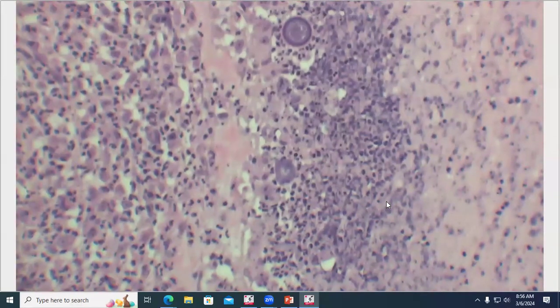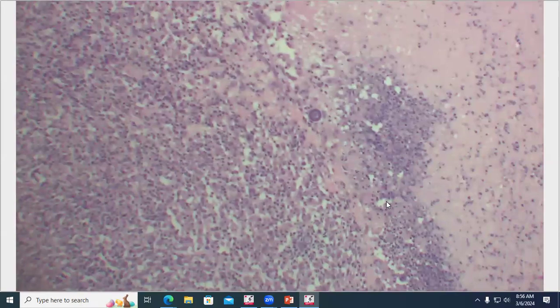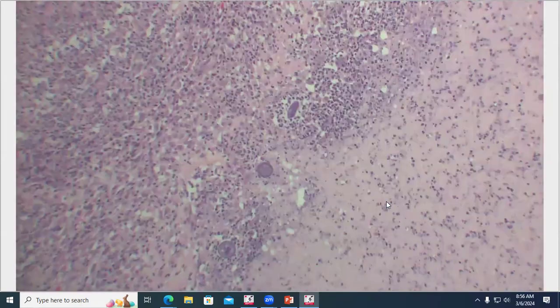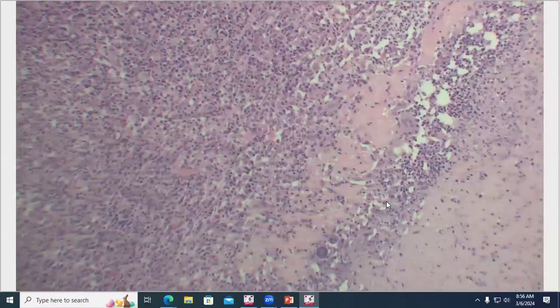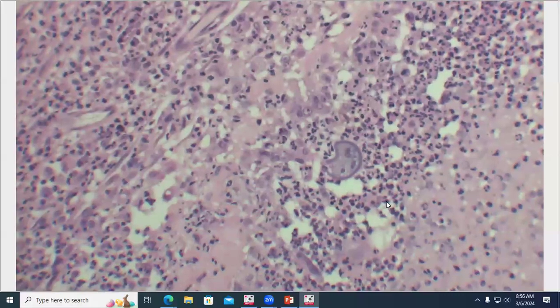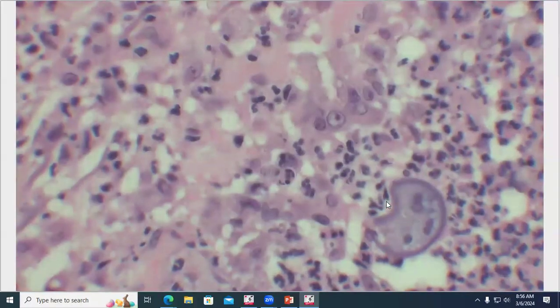There are other really cool examples of these guys rupturing, but we've seen a lot of good examples already. Yeah, it is a very interesting thing. There's some biological explanation for that I don't think we know, but in dogs, if you find one, you're kind of lucky. They're very easy to identify, so it's very unlikely that we're missing a lot of them. But in cats, the ocular coccidioides infection tends to have lots of organisms like this.